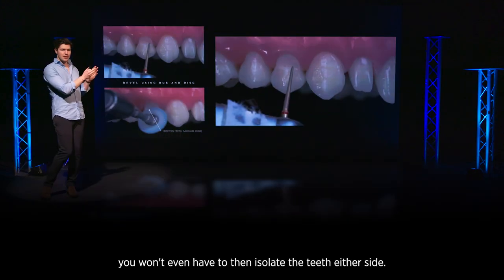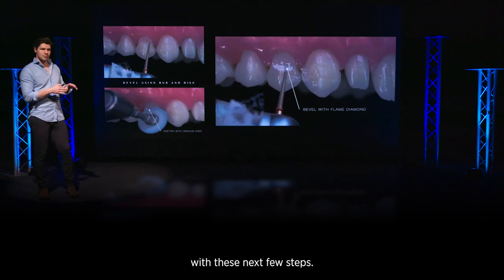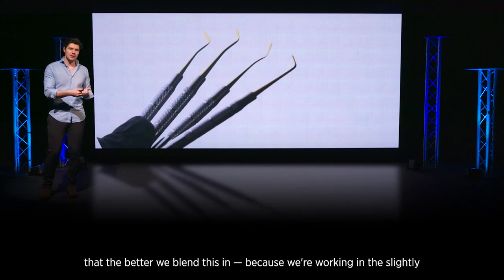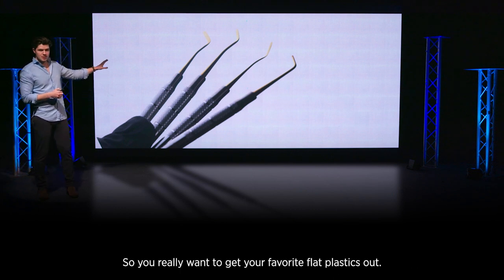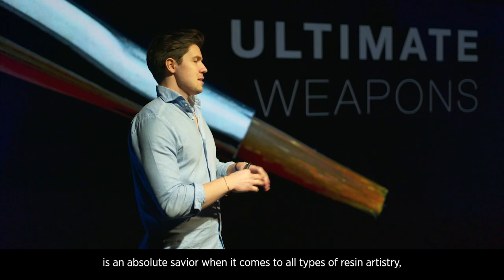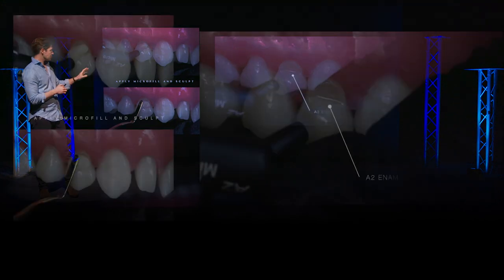If you're really delicate, you won't even have to isolate the teeth either side — it depends how careful you can be with the next few steps. Really key now is using the right tools, because we're working towards the side of the mouth with a little less space. The better you blend this in, working at a slightly different angle, the more time you save in finishing and polishing. Get your favorite flat plastics out, and the ultimate weapon — that number three brush — it's an absolute savior for all types of resin artistry, especially a Class 5 restoration.